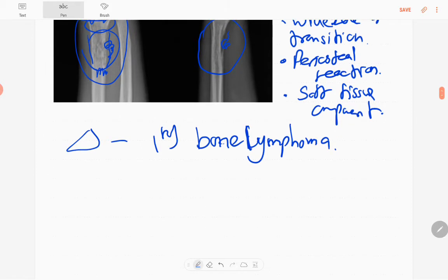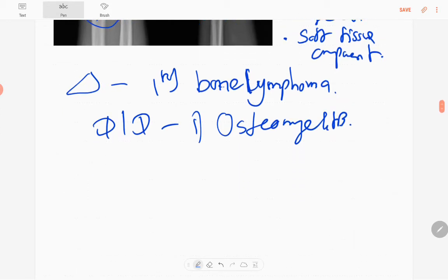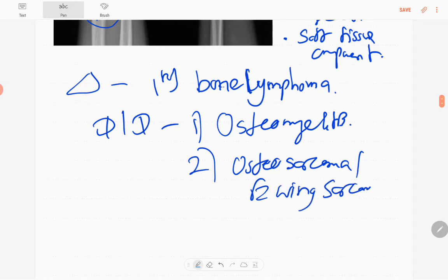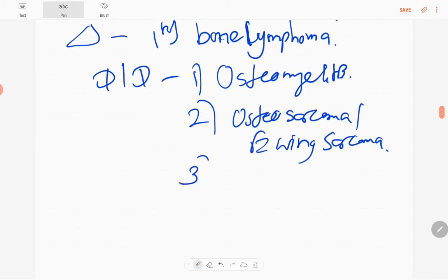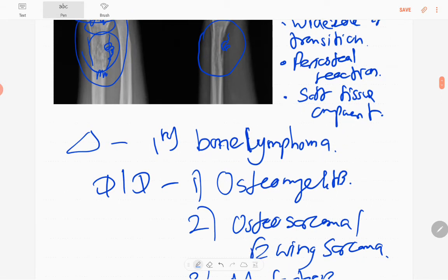The differential diagnoses are: if this patient has fever and tenderness in the wrist joint, we can think of osteomyelitis. If it is a young patient, osteosarcoma or Ewing sarcoma should be considered. Another differential is metastasis. These are the aggressive lesions which can occur in this area, except for osteomyelitis.